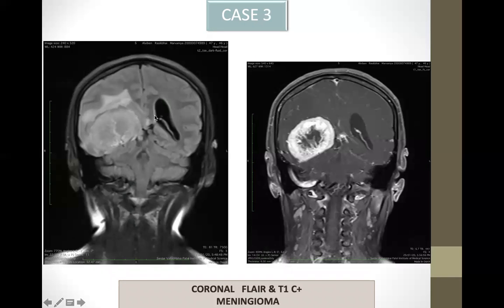This is a non-contrast FLAIR image as well as a post-contrast coronal image of a case of meningioma with internal non-enhancing necrotic areas.